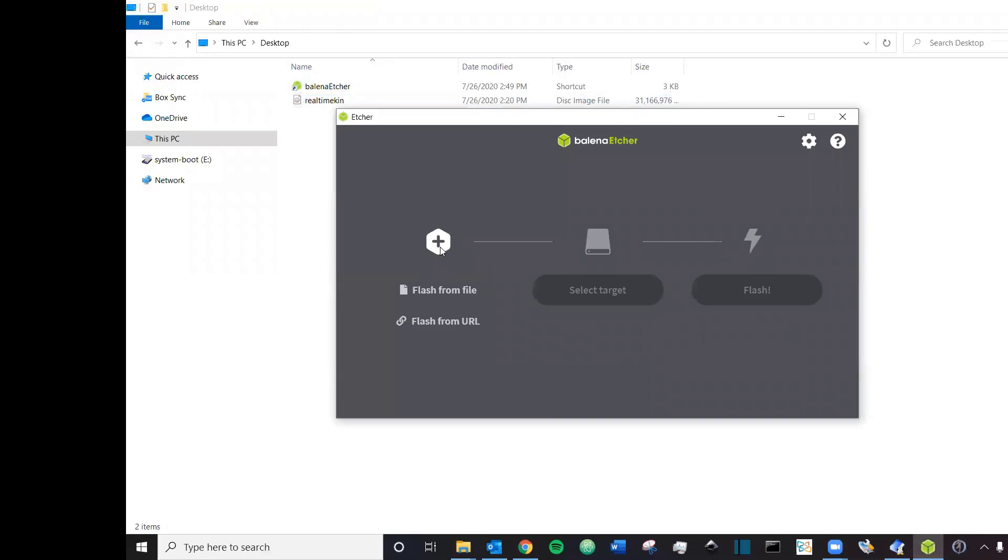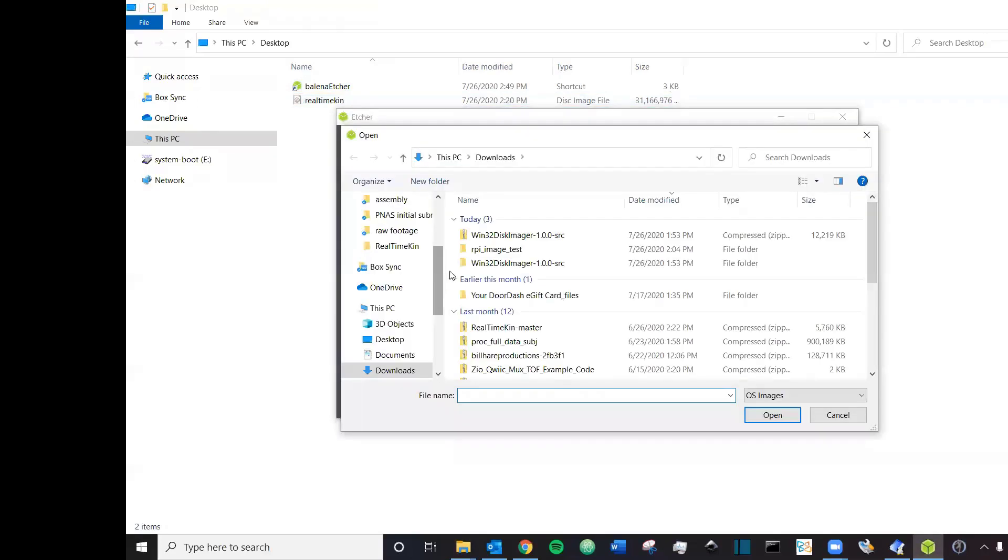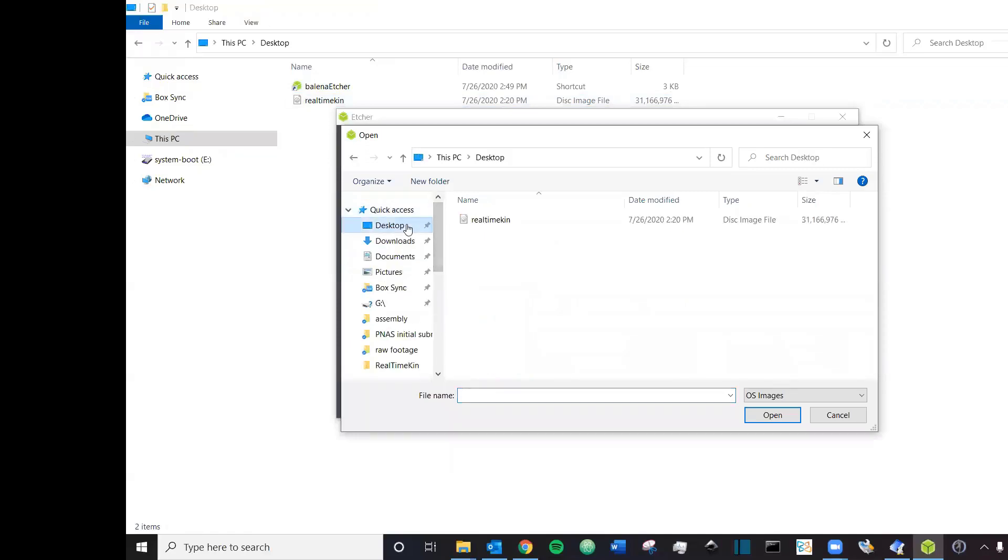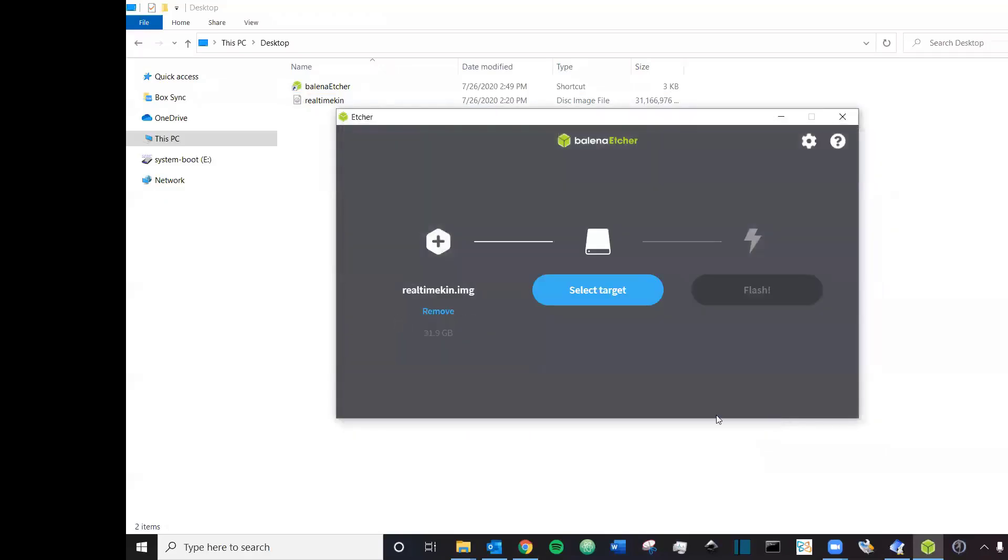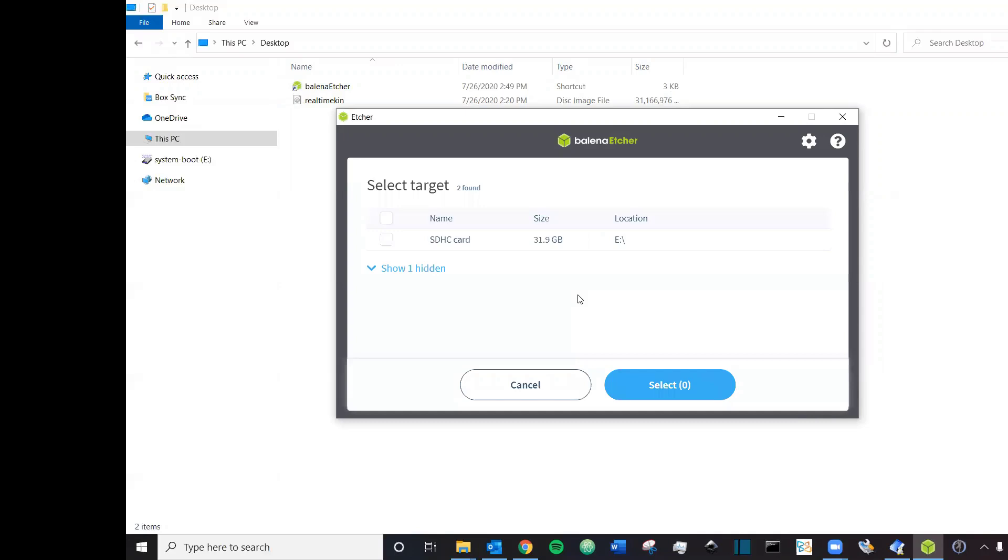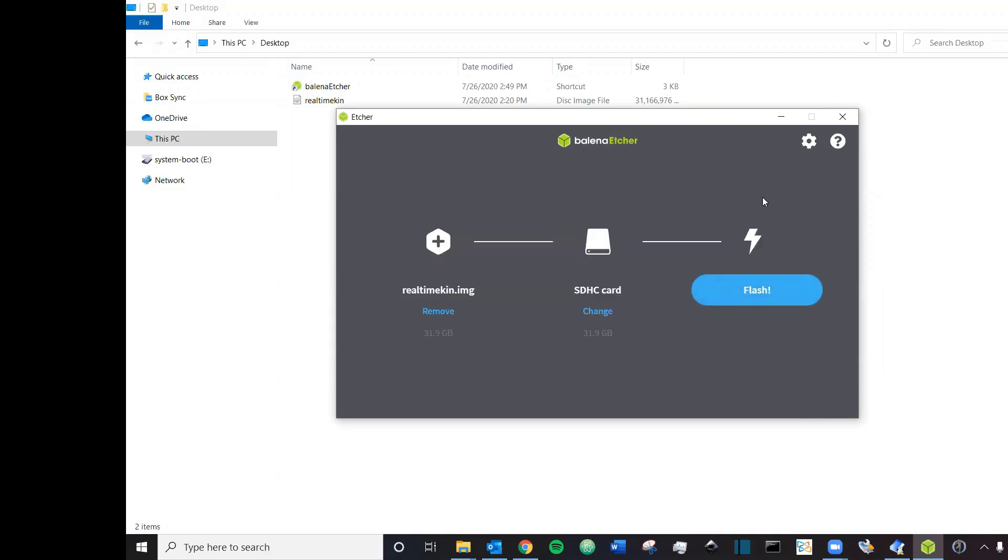You'll click flash from file. You'll go to wherever you have saved this image. Click open. You can see here, click the right image and it's 32 gigabytes, which is why you need a 32 gigabyte SD card. Now we'll select our SD card, which is this one. And then you can go ahead and click flash. When you click flash, it will take about five minutes or so and it'll copy everything to the SD card. Once this is complete, you can eject your SD card from your computer, put it into the Raspberry Pi and you are ready to boot up.